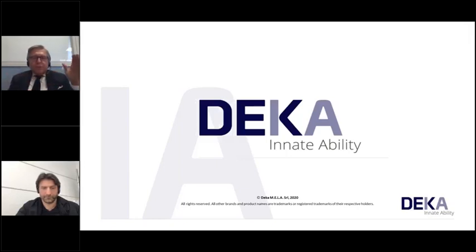Because with Onda, our target is the fat, and we recall back the heating from the depth, and we can tighten the skin in a sort of upside-down thermal injury, because we recall back the energy and we tighten the skin. But it's better not to overlap the two procedures, because the CO2 tightens the skin and gets it firm from outside. So there is the risk of overlapping too much, and we don't see exactly what we are doing in our protocols.